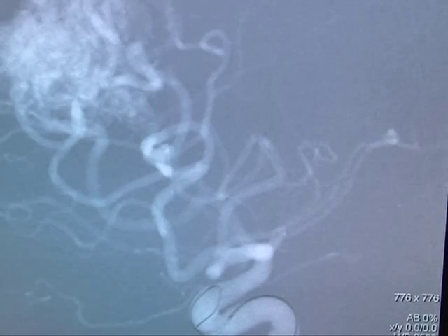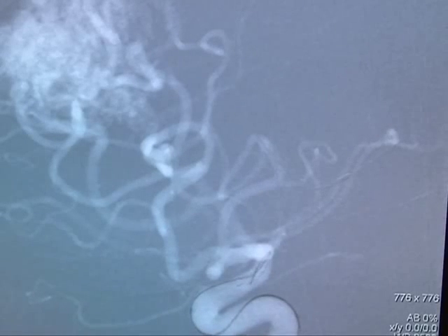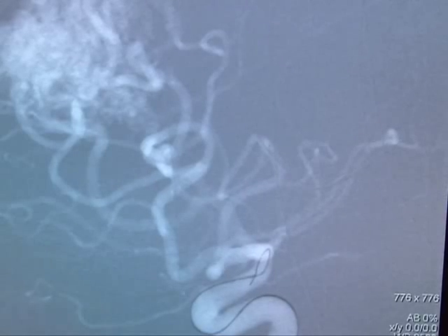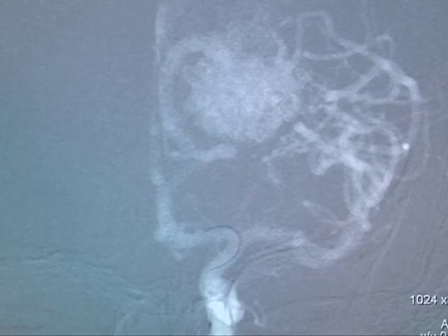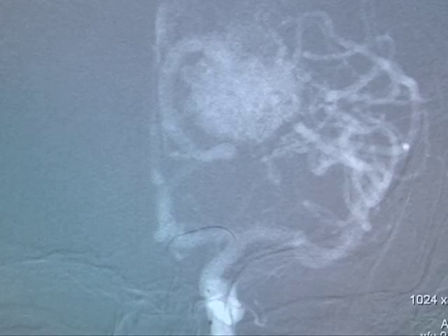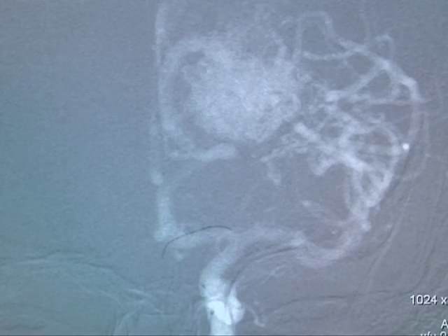Here, a small microcatheter is advanced through the blood vessels. It will be sequentially placed into each of the blood vessels that is supplying the arteriovenous malformation. The catheter is being advanced over a small microwire into one of the anterior cerebral artery branches that is feeding the arteriovenous malformation.